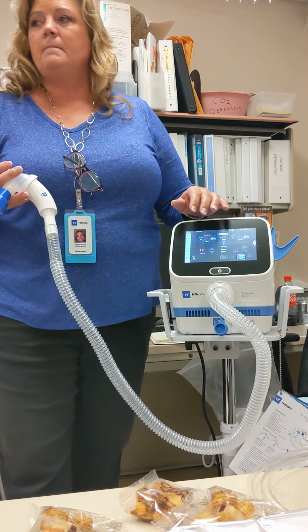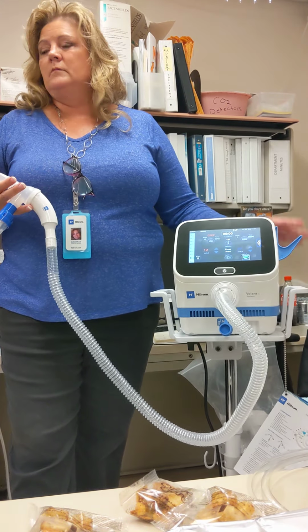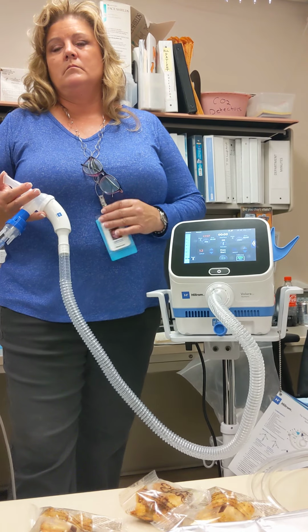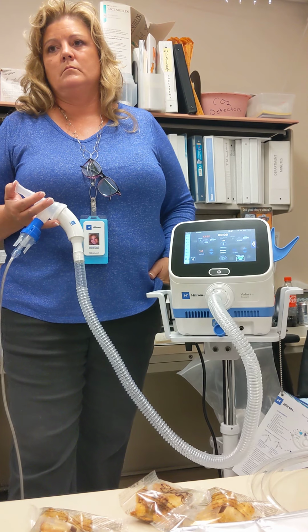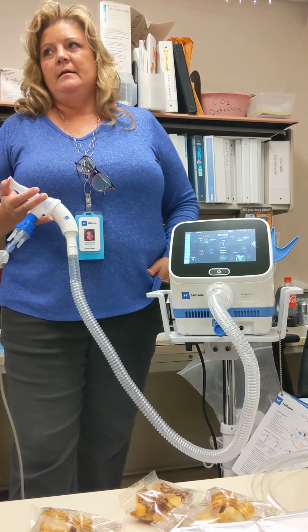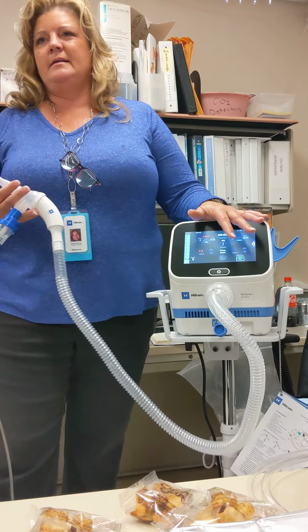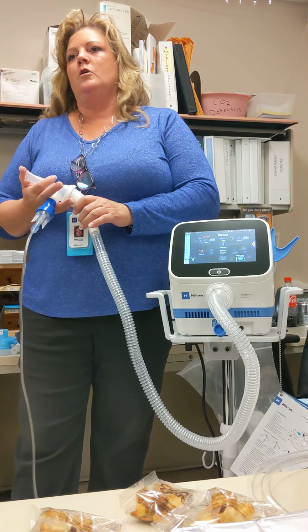So what Karen is saying is, if you move this from room to room to room, when you find that sweet spot for their treatment, you can program it into your automatic mode. What I would suggest doing is putting the patient's room number there. So 203, and then the settings are pre-programmed. 207, this is what they use. You can't adjust it then. We currently can't get into an automatic mode to program anything. You're locked out, I think because of what our issue has been.